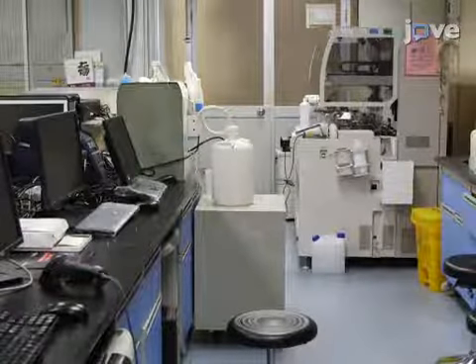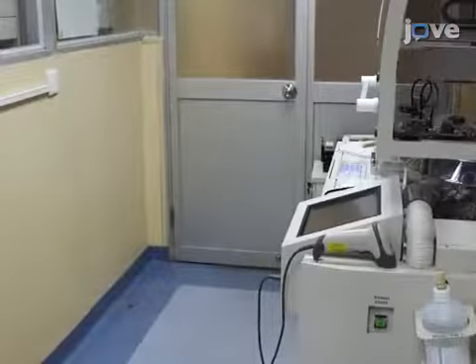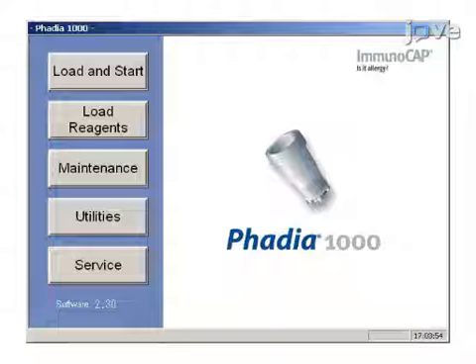After retrieving the serum samples of eligible patients from the biobank, turn on the fully automated immunoassay analyzer and the built-in information data management computer. With the primary power on, switch the instrument to the system power and wait 3 minutes for the built-in software to start.